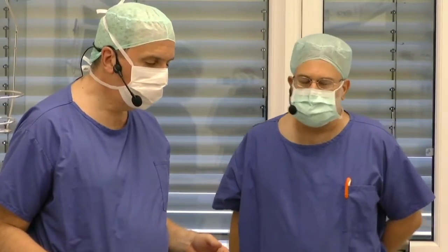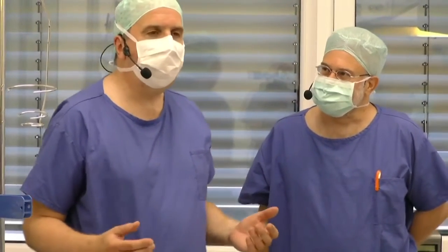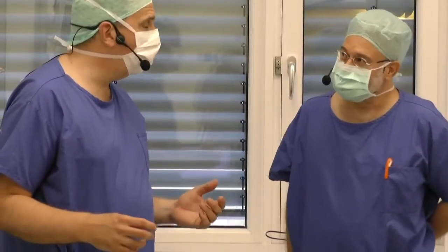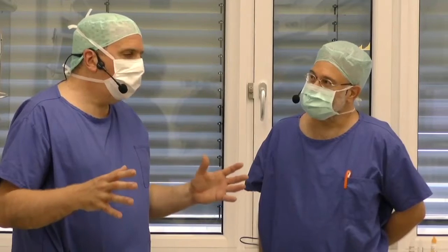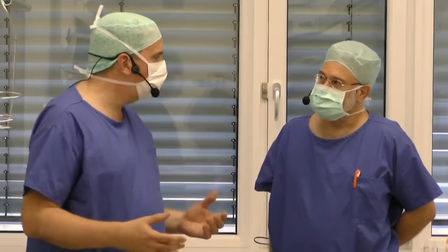Why do you like this piggyback system? I don't think I was the first to implant the add-on IOL, but I think among the first 10 who did it, and it was 10 years ago. This system is called Liberty, and I like the name because you have the liberty to adapt your lens system to the visual and the refractive needs of the patient.